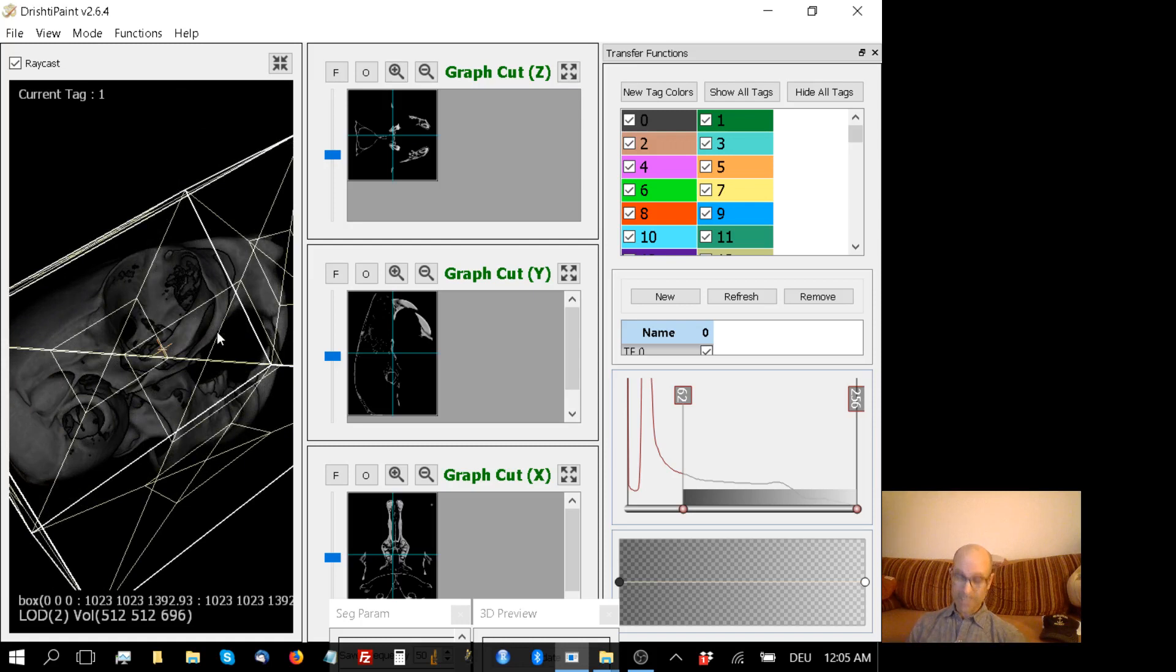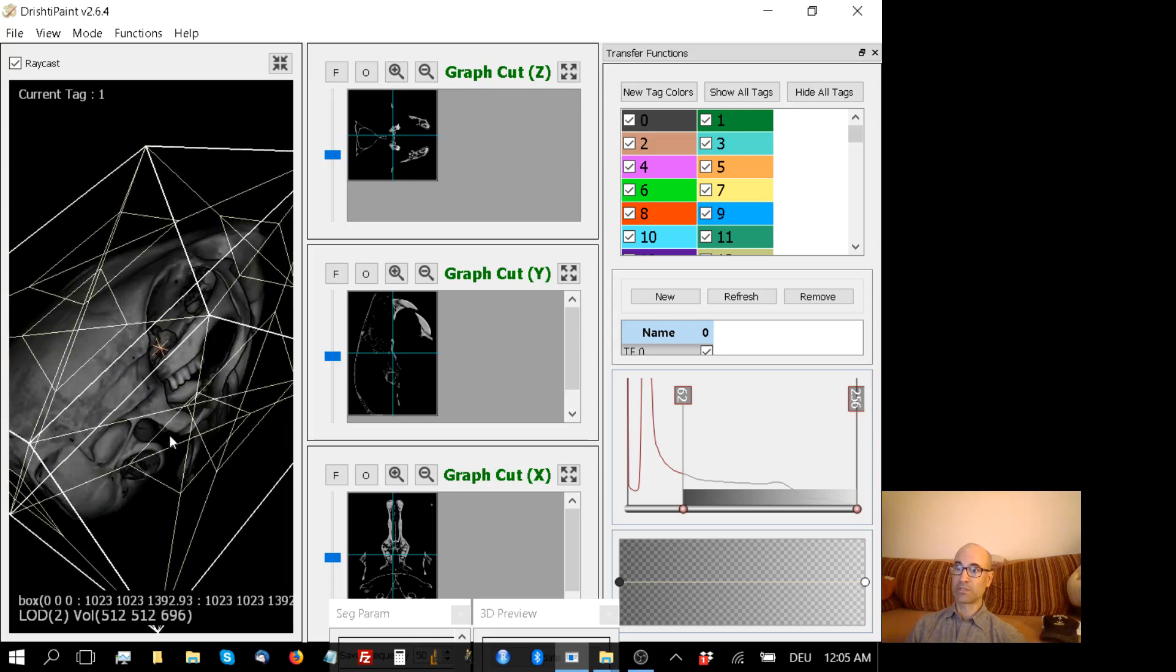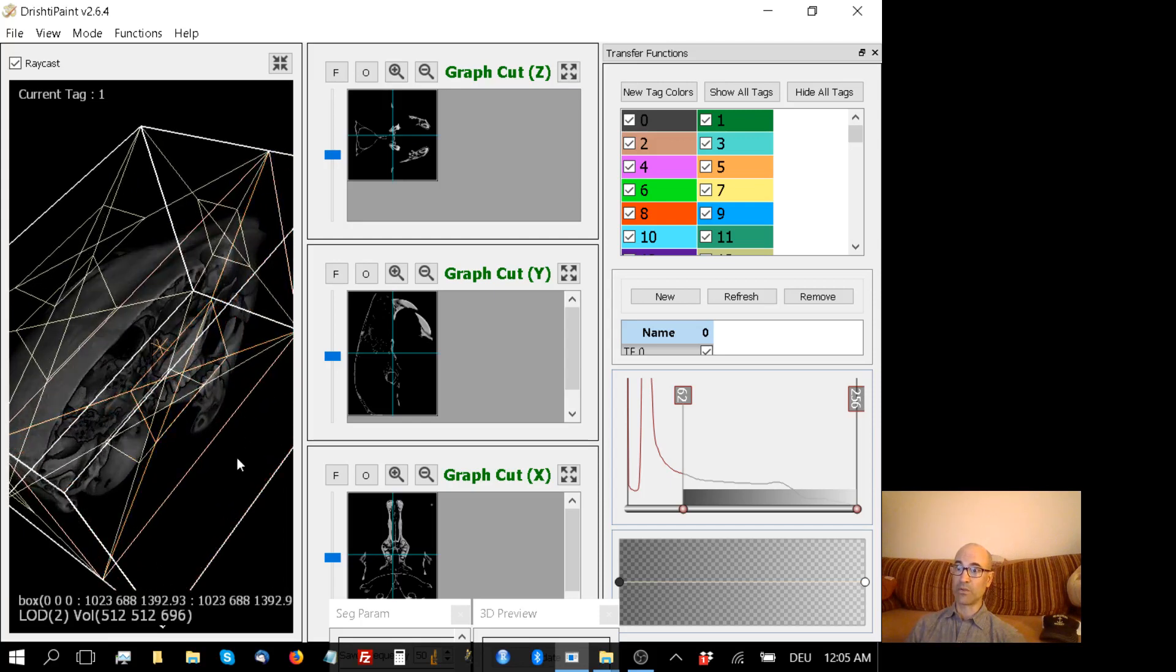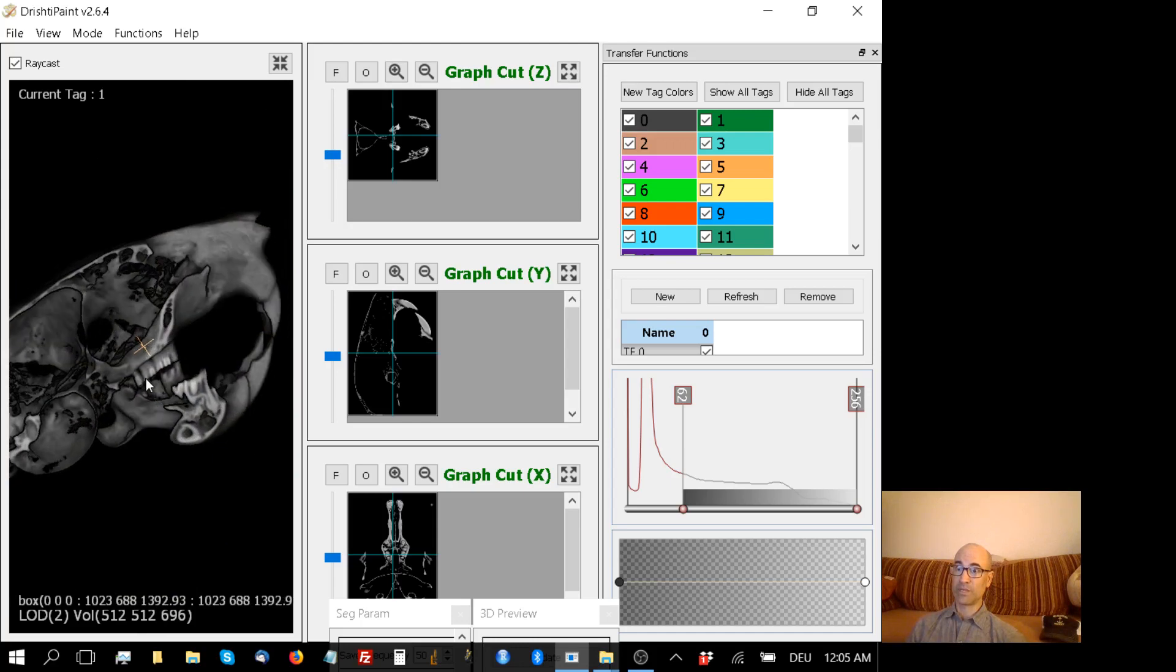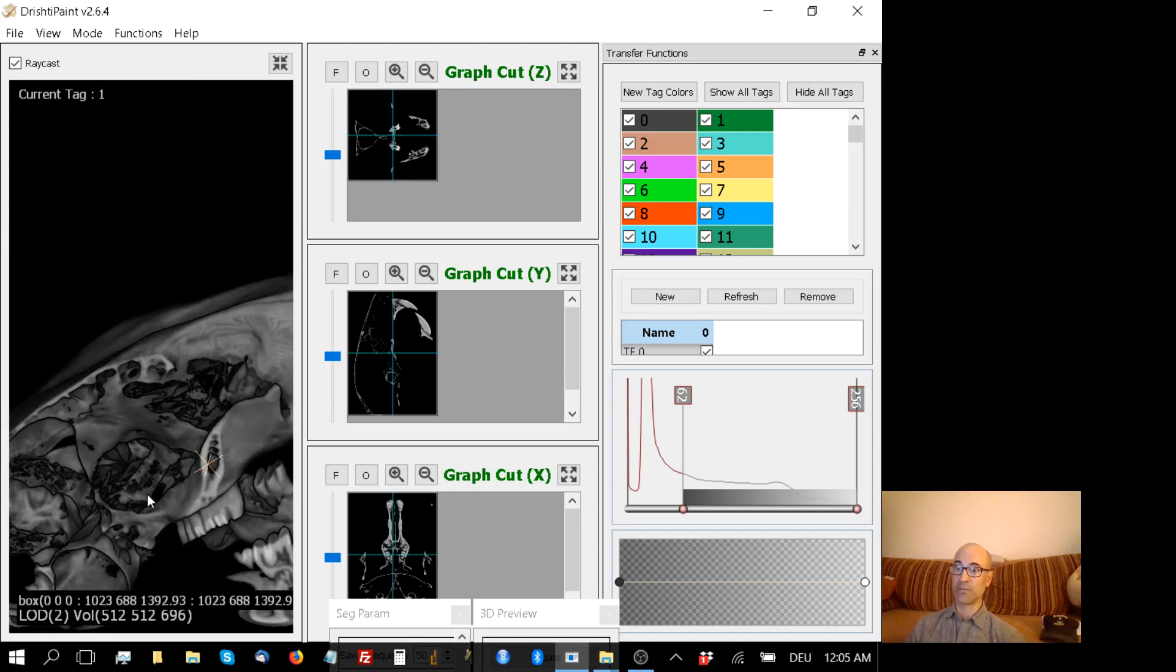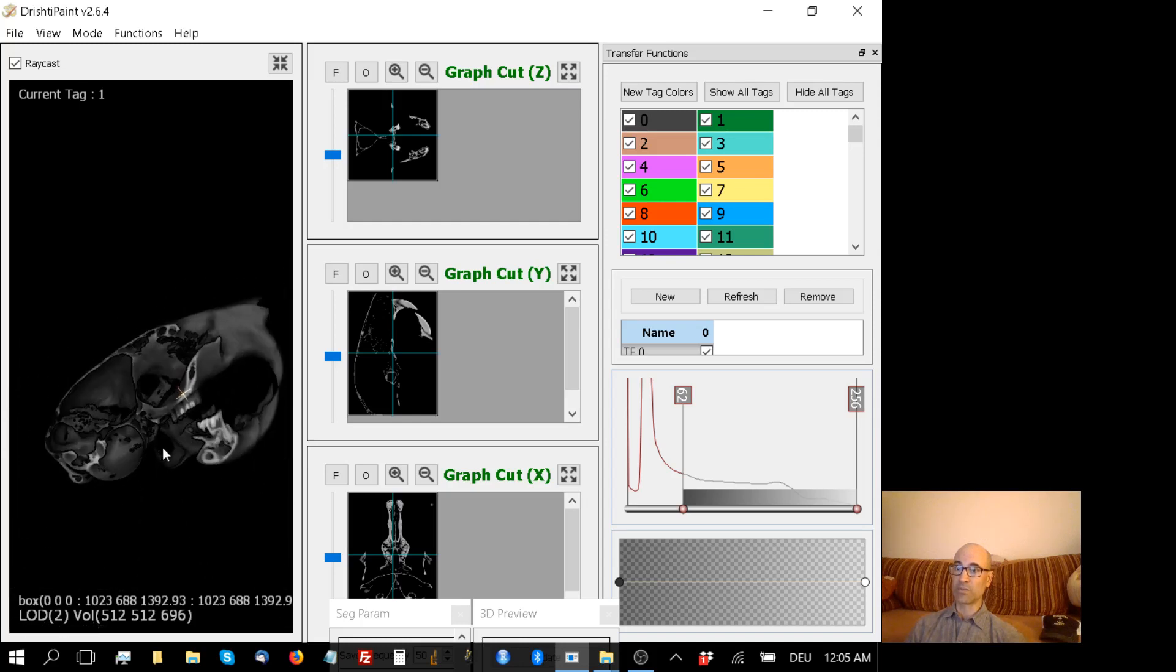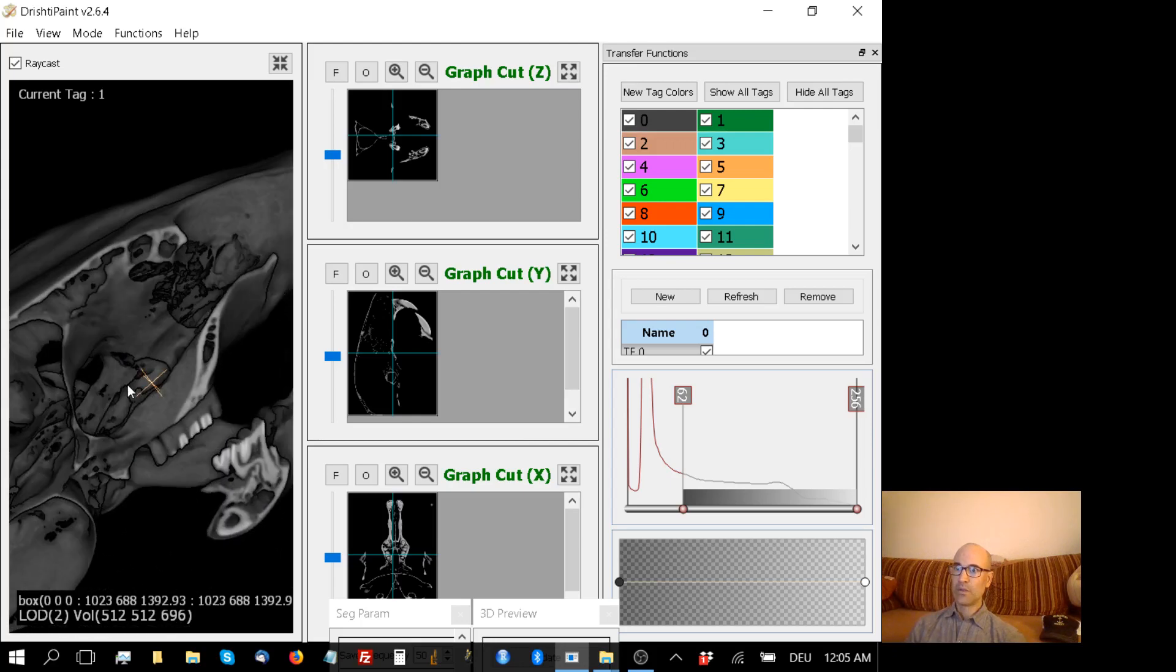A couple basic keyboard navigation shortcuts: B gets rid of this box with anchor points. This box is crucial - by clicking on any of these anchor points and moving it, you can look inside of the volume. Press B, and that gives you a less obstructed view. I can look right inside the brain case of this animal. I can use the mouse wheel to zoom in and out.